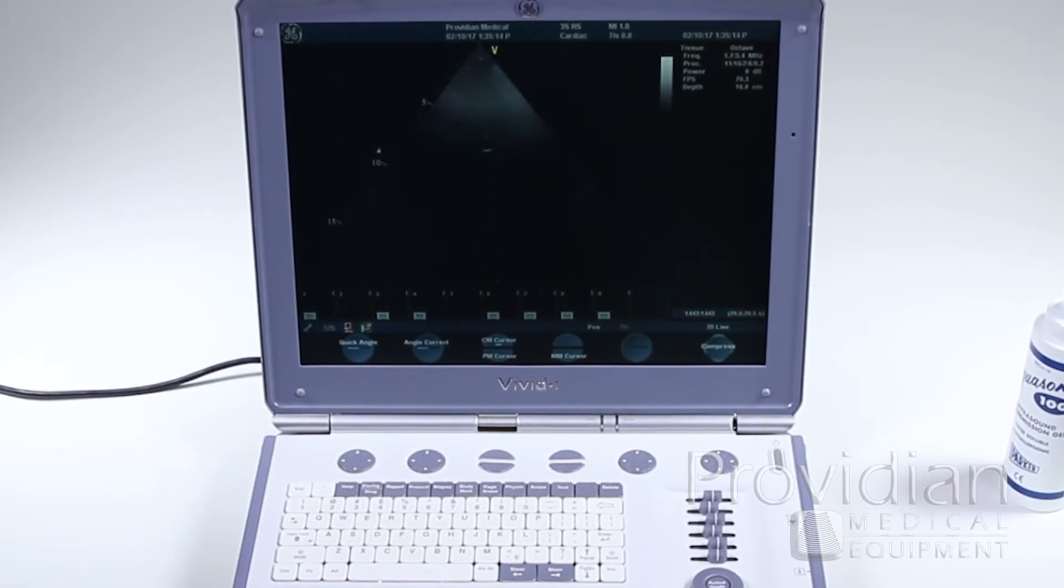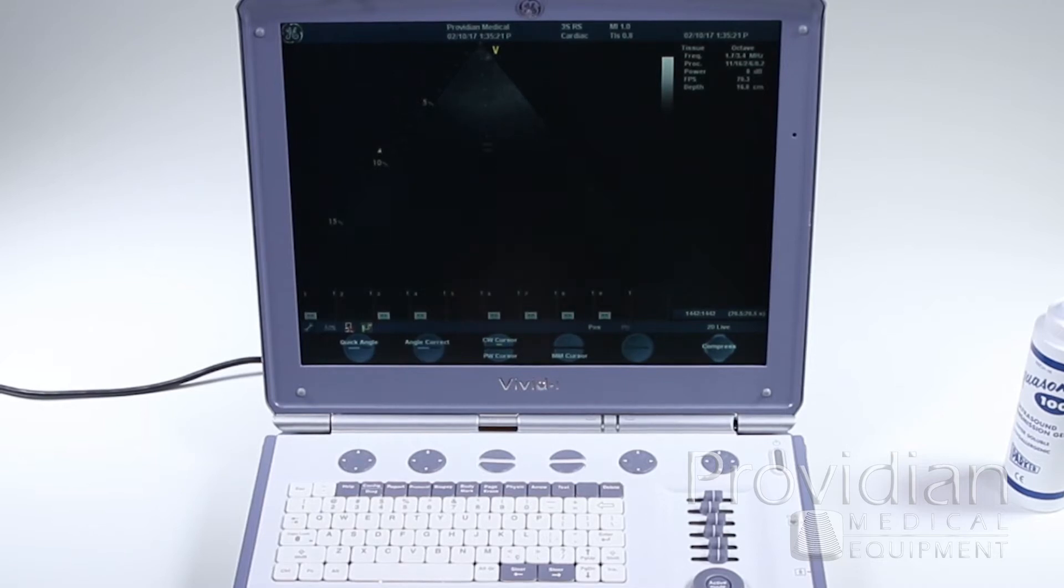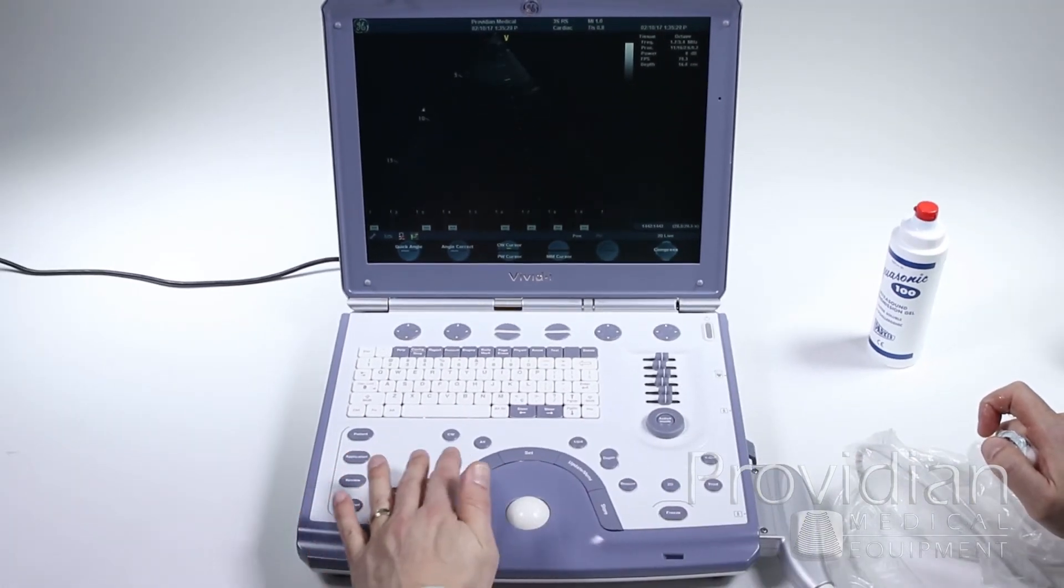We can start, and I've just got my thumb on the probe just to show that it is a live image. So we can do the cursor, select the area that we want to listen to, so let's just say it's right about there, and then we can click into pulse wave or M-Mode Doppler.